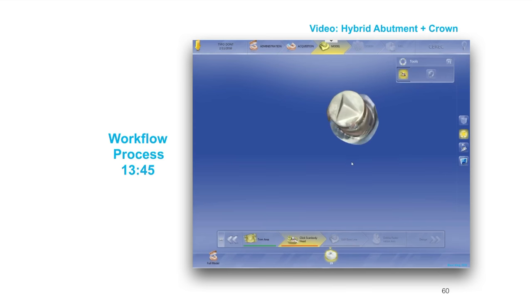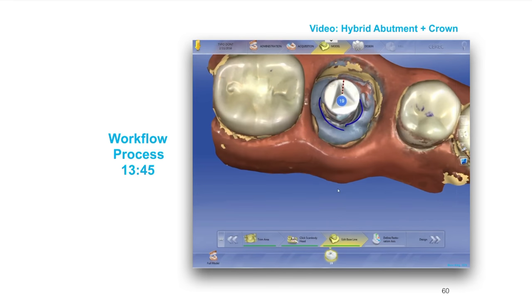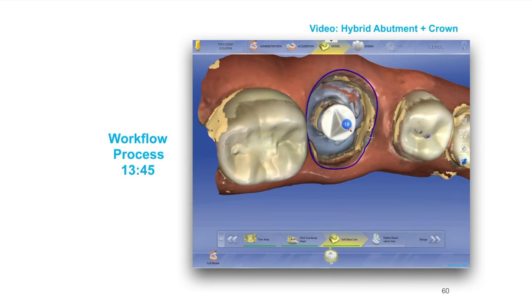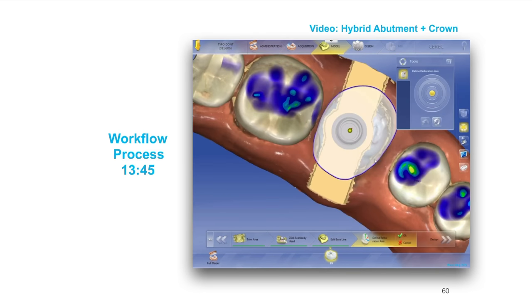Once you've trimmed it, you're going to click the scan body head — that's right at the tip of the pyramid. Then we're going to get the edit baseline. This edit baseline step is basically telling the computer where the emergence from the tissue is. This can be edited later, so we're not necessarily too worried about making this perfect, but I would suggest spending some time making sure it's easy to work with. Clean it up a little bit and make it look more like a natural tooth emergence profile before you move to the next step.